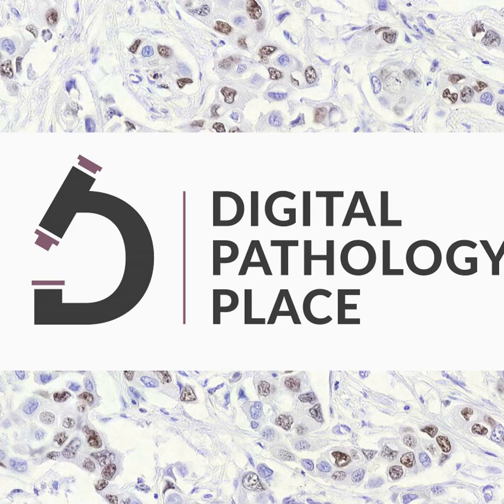4. Semi-supervised learning. Semi-supervised learning is an approach that combines aspects of both supervised and unsupervised learning. In this scenario, the machine learning model is trained using a small amount of labeled data supplemented by a large amount of unlabeled data. The idea is that the machine can use the unlabeled data to better understand the underlying structure of the data and make better decisions on the labeled data. This approach can be beneficial when labeled data is scarce or expensive to obtain, as it can improve model performance with less need for manual labeling effort.